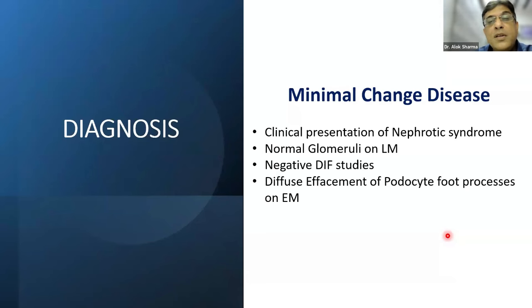So these were the 2 cases which I wanted to highlight, the podocytopathies, if you want to call it. If you see here, there were no deposits in these cases, right? Now there will be cases where you have glomerular disease with deposits, and that is where we will head in our next case. Okay.